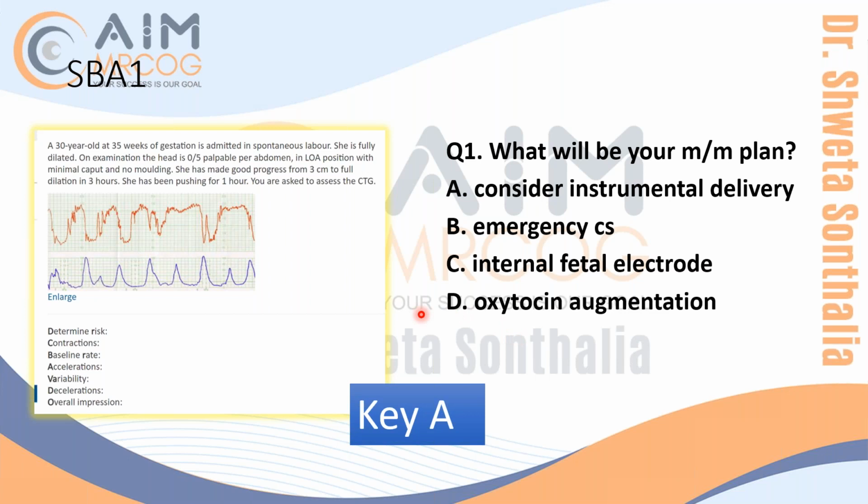I mean, honestly speaking, I'm still very confused about the CTG because I felt that there are three decelerations which are sustained and almost more than 2 minutes. Yes, you're right. So that is why it is concerning. That's why you're delivering.